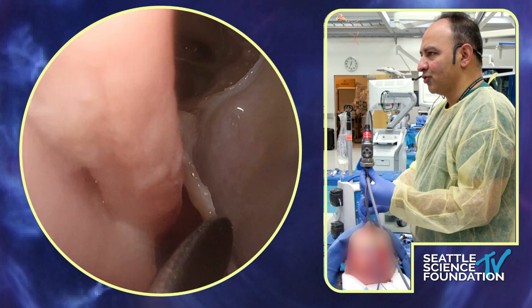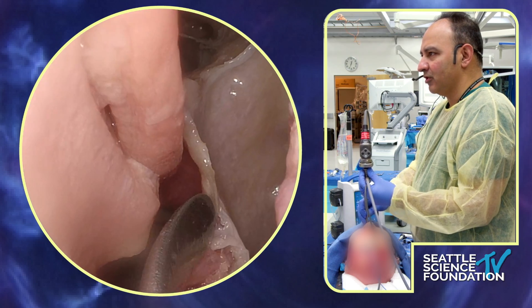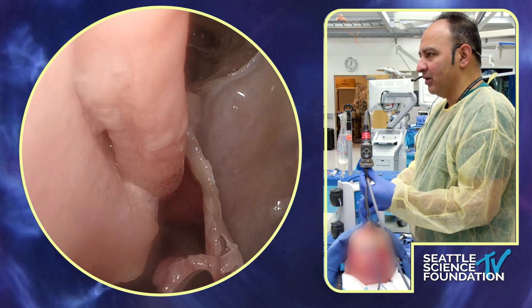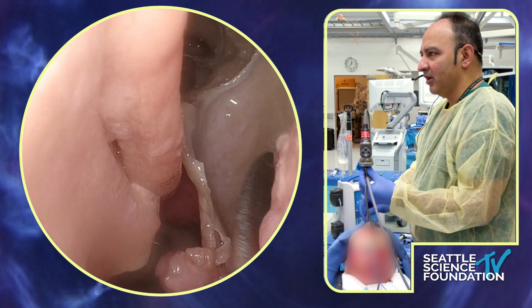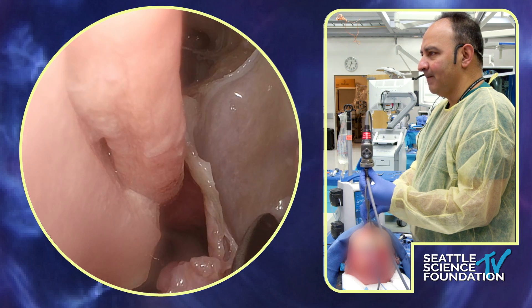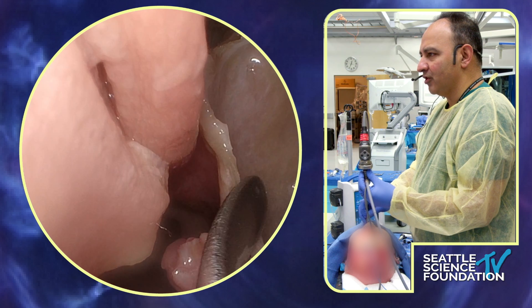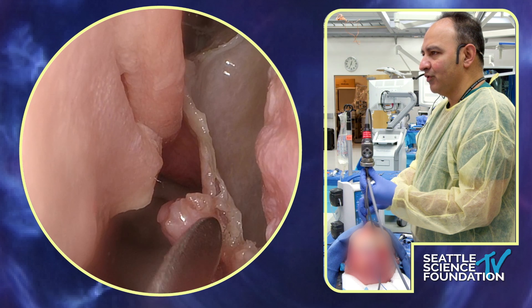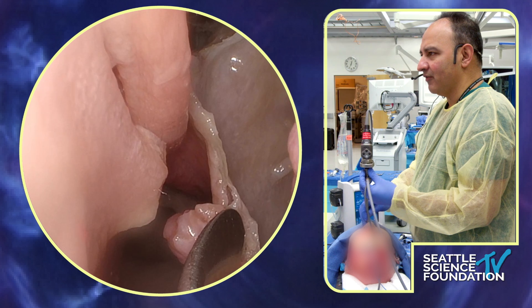For me, this is part of my approach for JNA surgery — if I have a larger one, I'll be working posteriorly, take down the back wall of the maxilla, and try to identify the artery laterally. More importantly, you can use this as a tool if you have a severe posterior nasal bleed. A colleague from Denmark tells me that in their country, every posterior nasal bleed is managed by otolaryngology rather than IR, using this posterior technique — take the patient to the OR, remove the packing, and proceed.